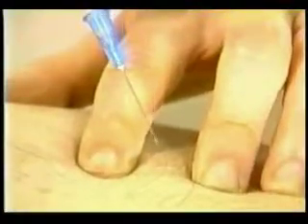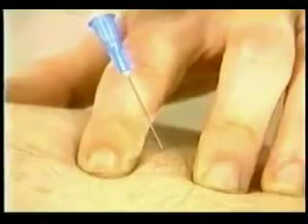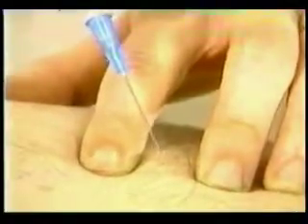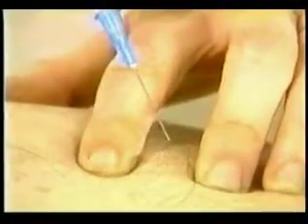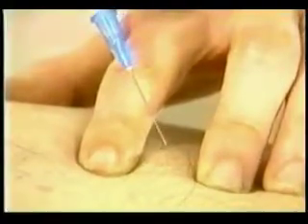Most people have a slight hand tremor. This may interfere with the exact needle placement, especially in small targets. Potential problems may be avoided by stabilizing the instrument, and this can be achieved in several ways.